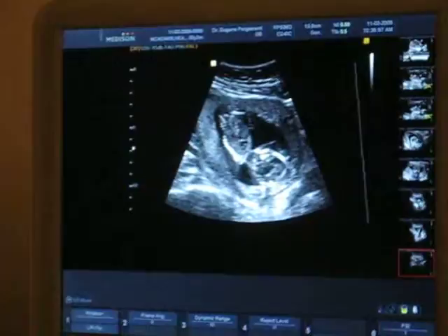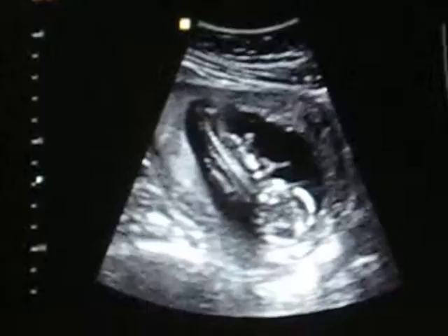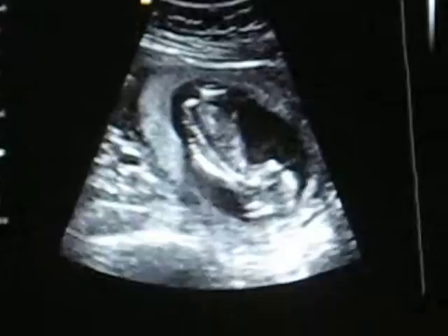It's even got its arms touching my sack, trying to hold itself up I guess. Is the head pointed down? Yes, down towards your feet.